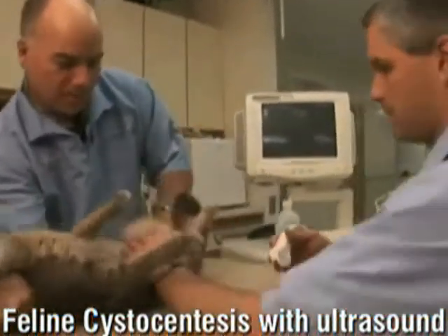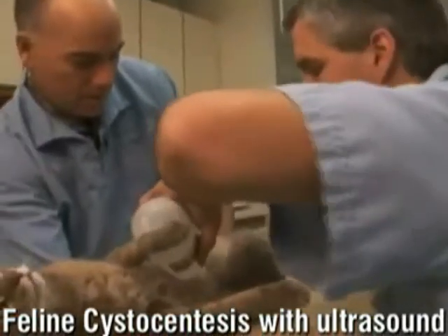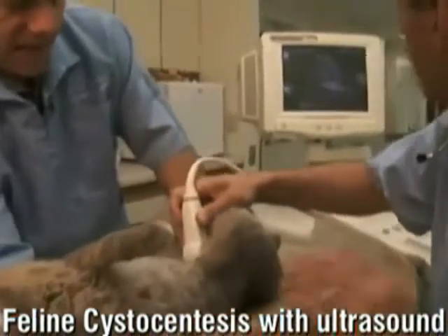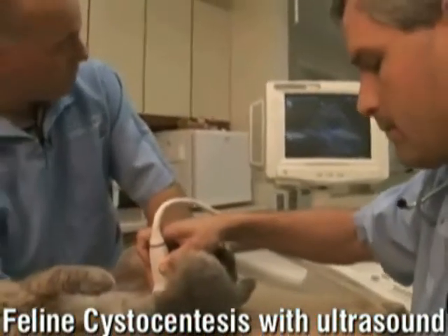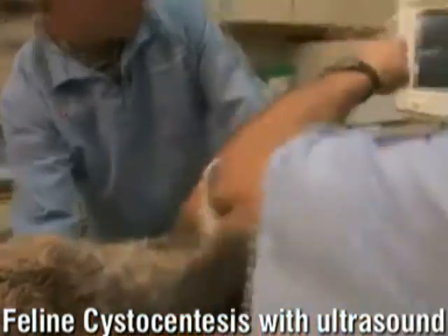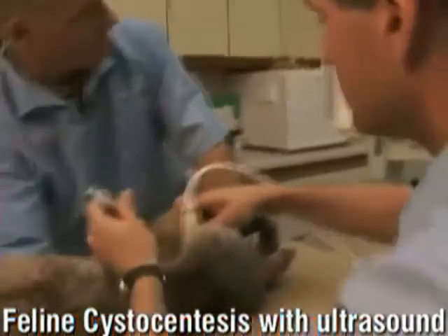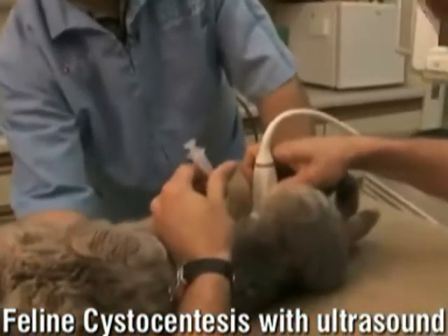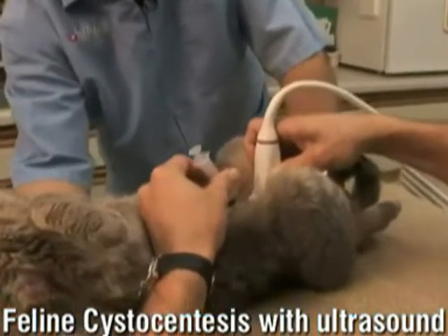Alright, so this is Bean — actually one of my own cats. She's volunteered to let us see if we can get urine. Her bladder is very small when I palpate it — it's too small for me to do a blind stick. So this is a great example of where ultrasound can really help you when the bladder is very small. Bob likes them on their back. Kind of the same technique as the dog. You can see her bladder is pretty small.